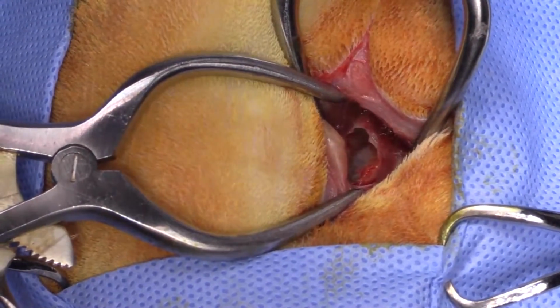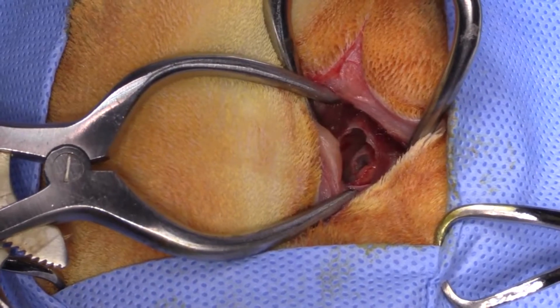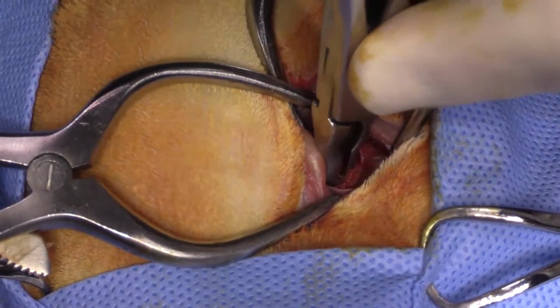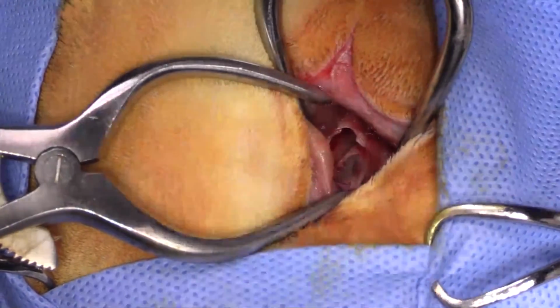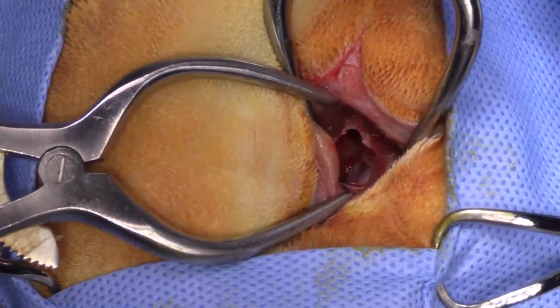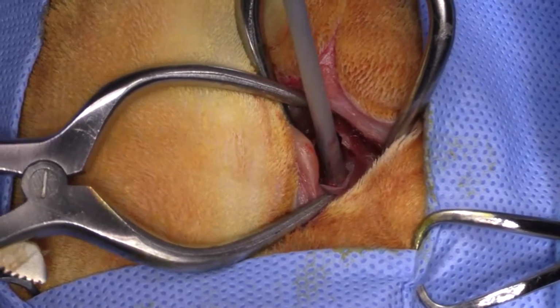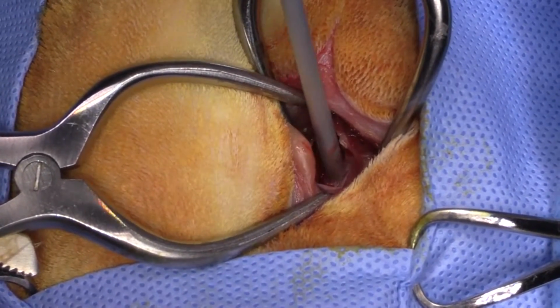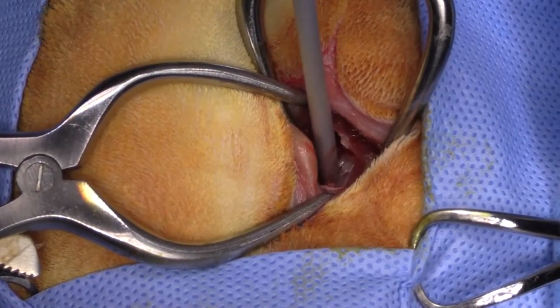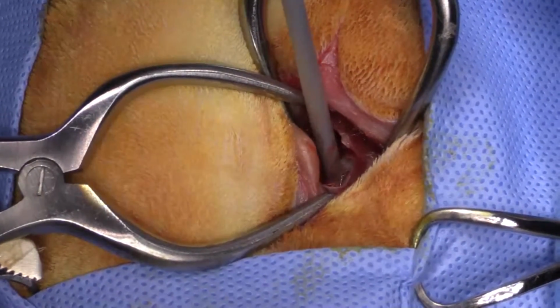Okay, so that's all cleaned out. That's the ventromedial chamber. And now I'm going with my pin into the dorsolateral. So you can see I've gone in there, and I'll extend that with my rongeurs. Sorry if my head's in the way. And again, that's more just mucoid material. That's the lining of the tympanic bulla right there. I don't know if you can see that being sucked up like that.